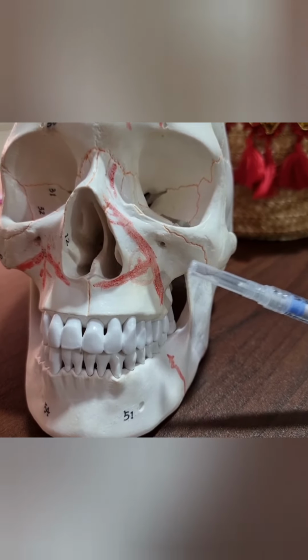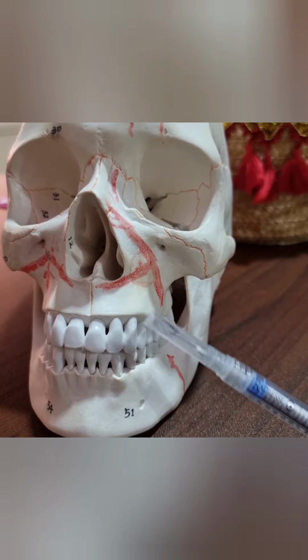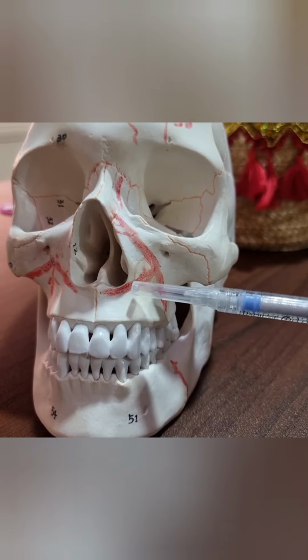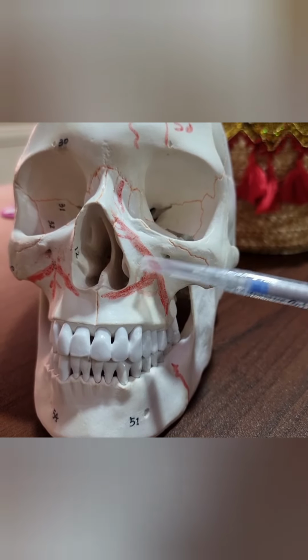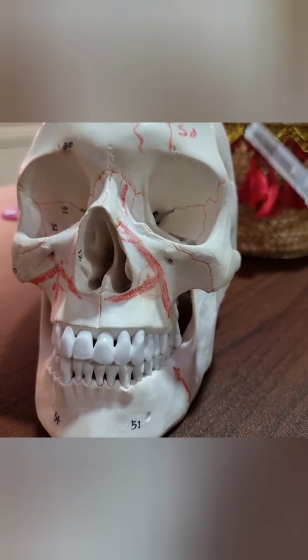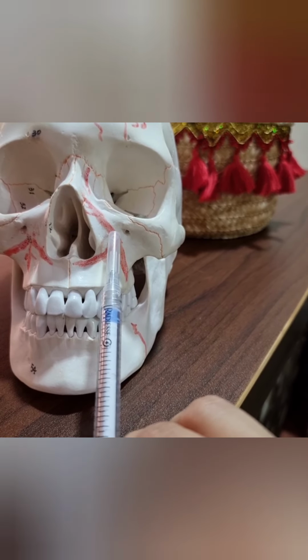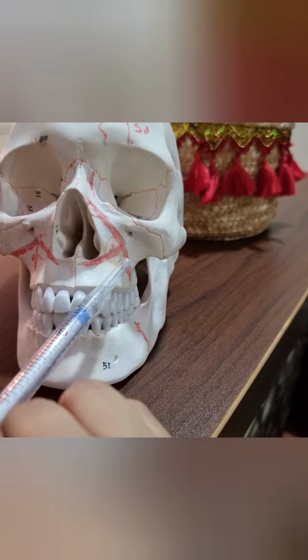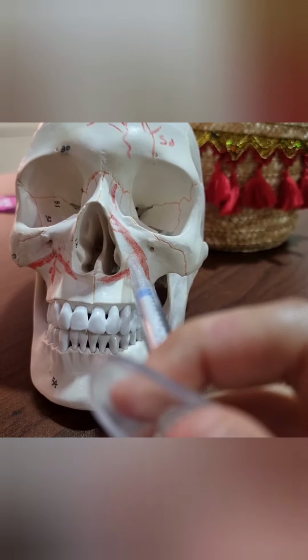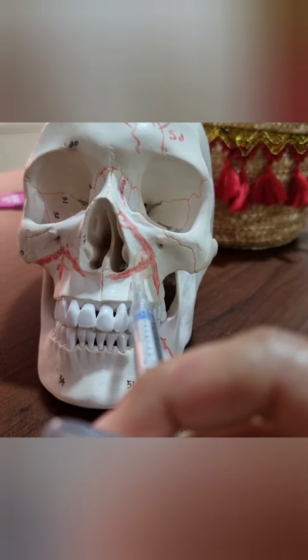أنا مسموح لي أحقن إزاي في الأرياز دي؟ The lower 2/3 is injected subdermal or subcutaneous, سواء بنيدل أو بكانيولا, it's okay: linear retrograde, serial puncture or ferning technique as we all know. But the most important area is this area, the nasolabial piriform space. Sometimes you go like that, you direct your needle upward or lateral, you direct your needle downwards, or sometimes you go up exactly perpendicular, it's okay, but in the wrong place, at the alar groove, not at the ala of the nose.